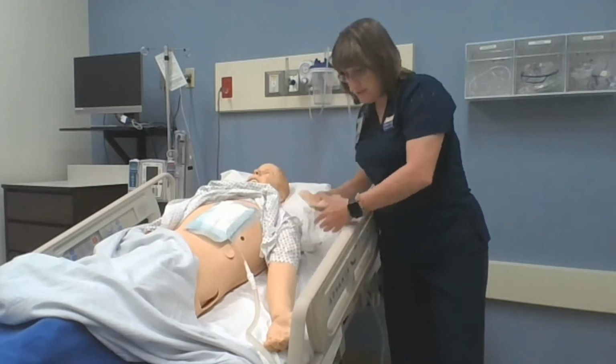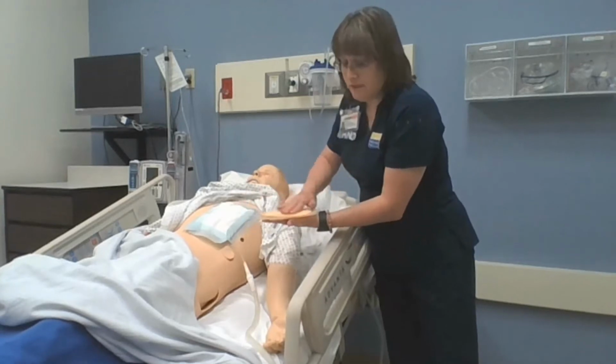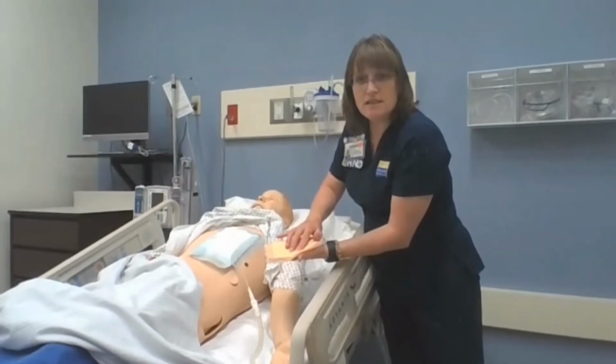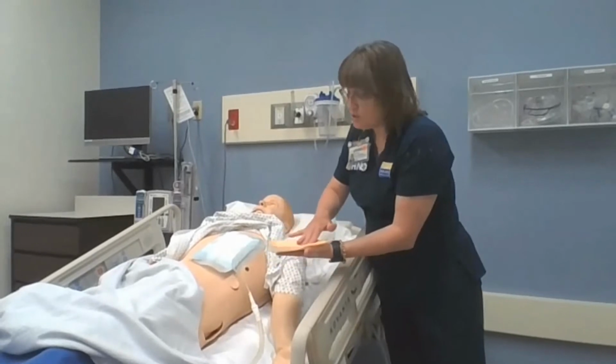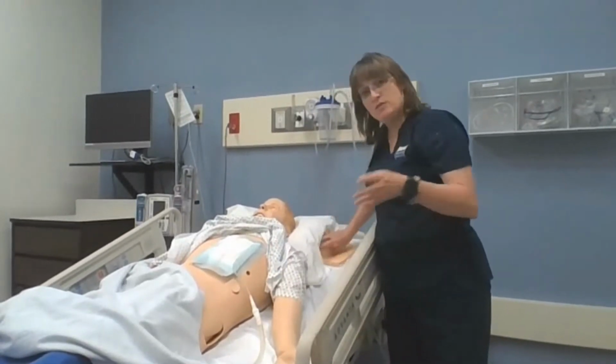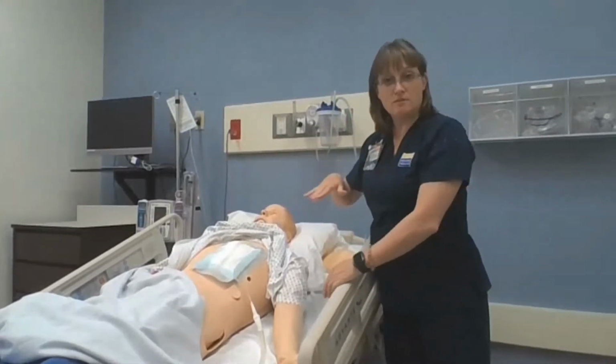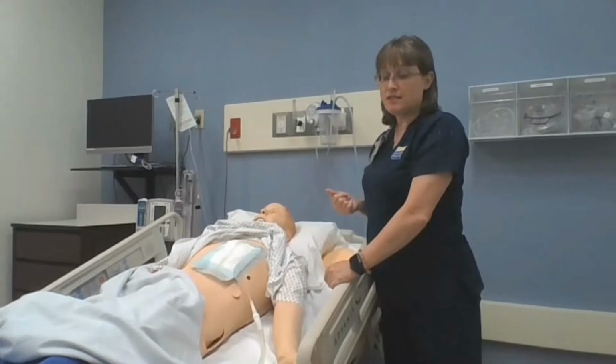Now, subcutaneous emphysema. When you guys come back out to the sim lab, I want you to feel this. It feels like Rice Krispies under the skin, okay? It truly does. It sounds like crepitus, but it feels like Rice Krispies, so we call it subcutaneous emphysema.